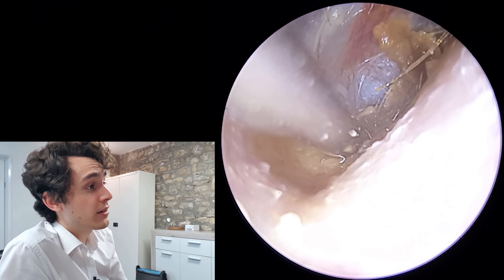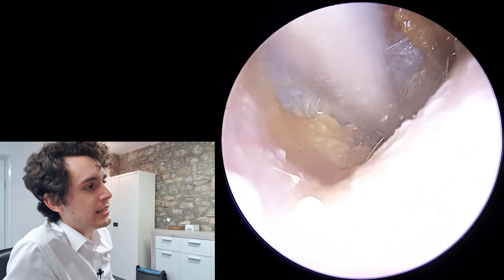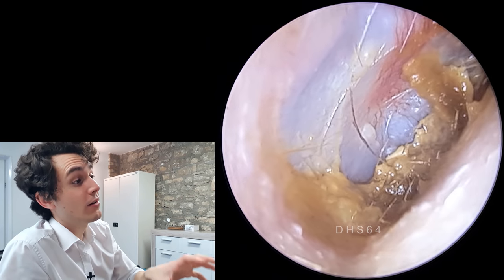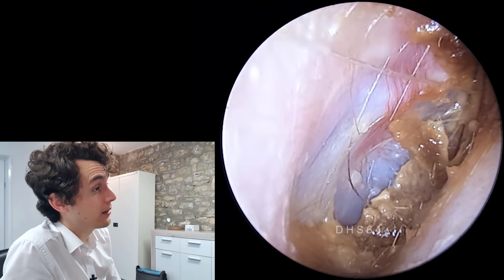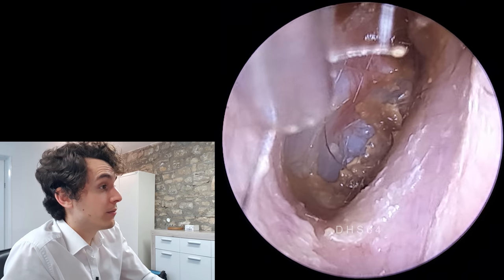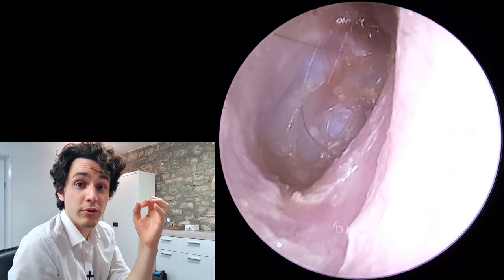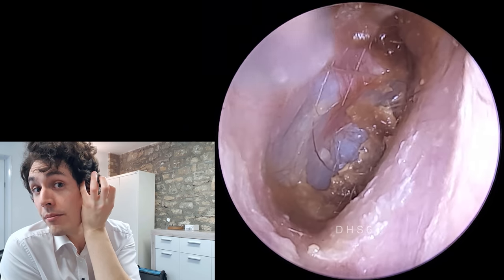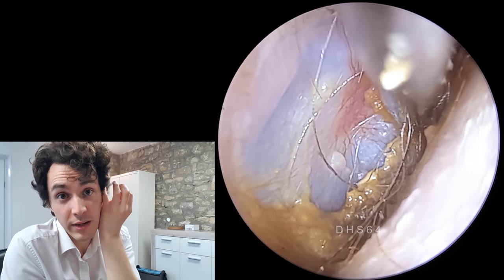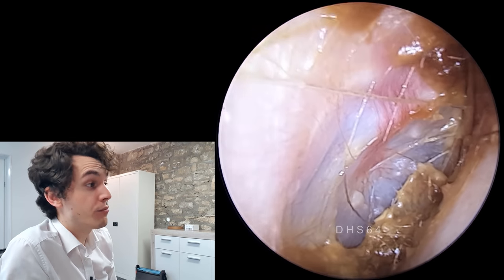The eardrum is looking significantly cleaner now. This sticky wax hiding in the recess unfortunately I couldn't get. We have to be very mindful that for safety reasons we can't linger down in the ear canal for too long — at this point I'm a tad nervous about grabbing stuff off the eardrum because it's a little bit riskier. So I'm using the brace position, which means that as I'm holding the suction probe, I'm resting my pinky and the rest of my hand on the patient's face, such that if he moves towards me the suction probe will actually move with the patient's head. That's called the brace position — the safest way of performing microsuction.